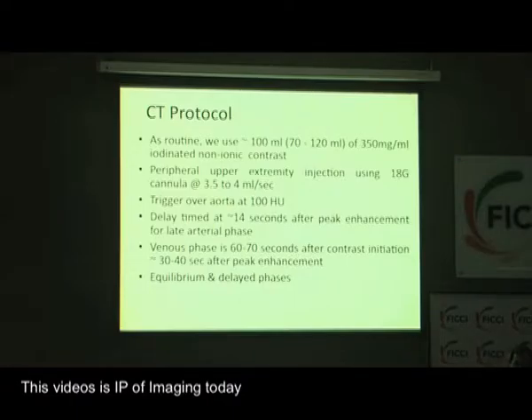It's important to remember that if you are looking for a late arterial phase, you have to wait an additional 6 to 8 seconds after that 6-second delay. This means if you're putting 100 HU as your threshold value, you should wait approximately 12 to 16 seconds after you achieve that threshold to get a delayed arterial phase, which is where you will pick up the hypervascular lesions.